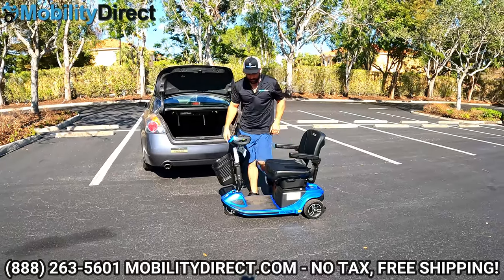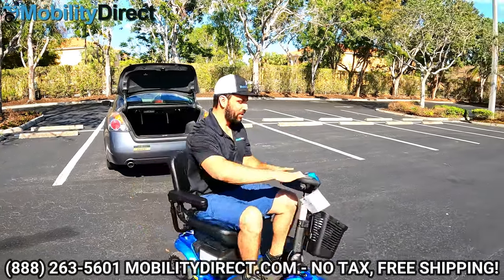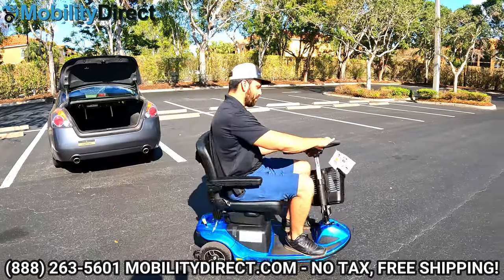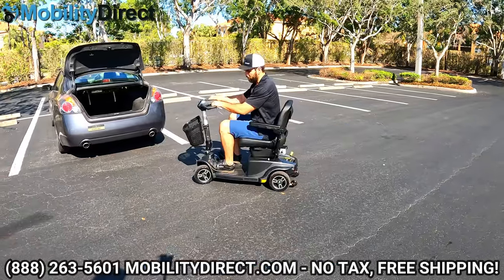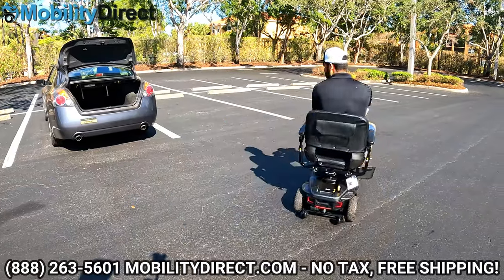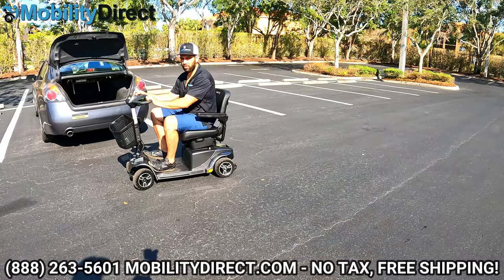The scooter's back together and working just fine. On the three-wheel, look how sharp it turns — really good turning radius. Now on the four-wheel, if I turn all the way, you can see it takes a lot more space to do a full turn. The turning radius, like I was saying earlier, is not as good. Figured I'd demonstrate that for you.